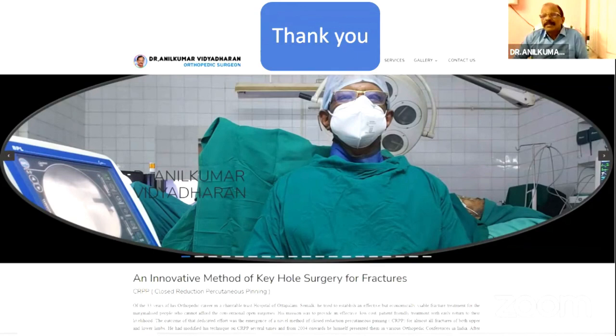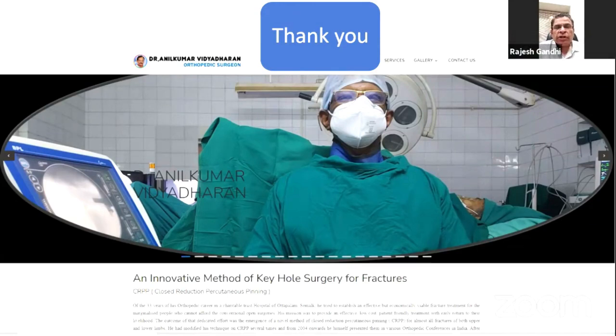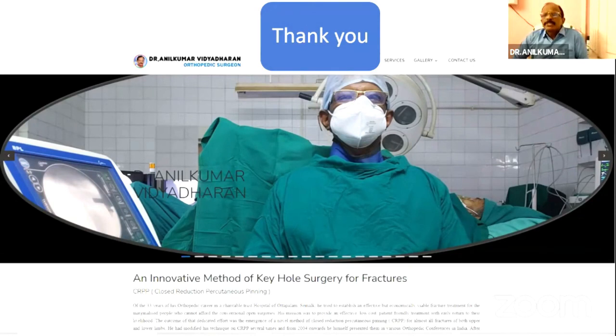Only one assistant will be with me till the completion of the first set of wires. After completion, sorry, sir. Because I am putting the first wire from the medial side, that is because the medial epicondyle we can feel and locate very correctly. From the lateral side, it is very difficult in a younger child to feel that area.